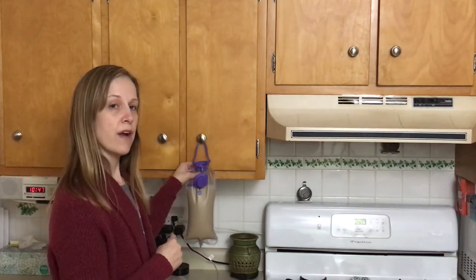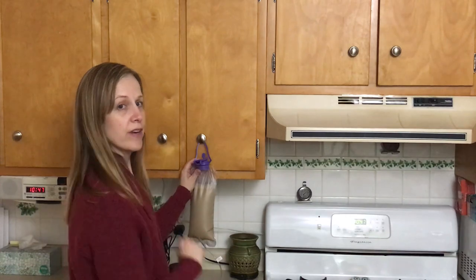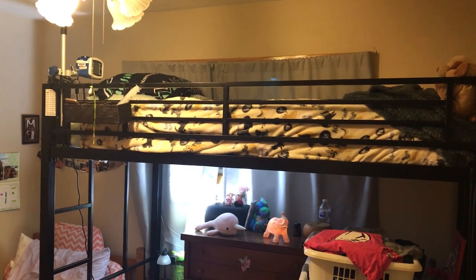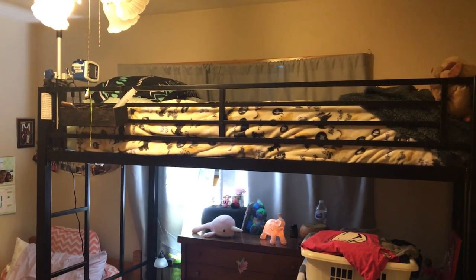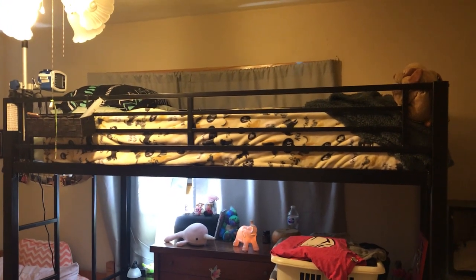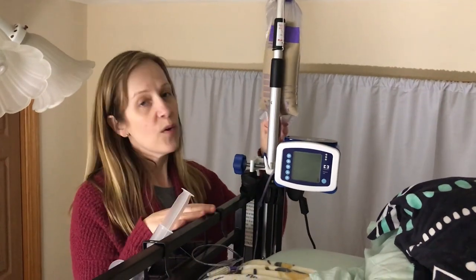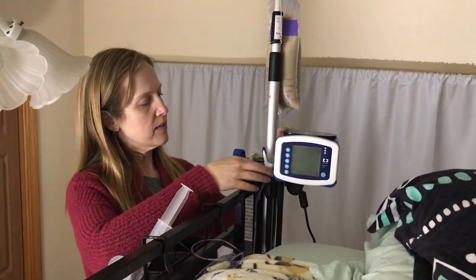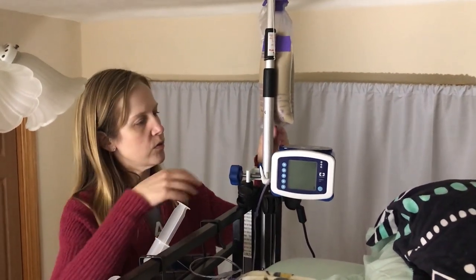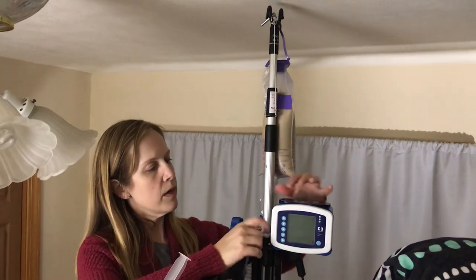Now that all those are in the bag, I'm just going to seal it up, and then we'll transition to her Kangaroo Joey pump and hook it up. Here you can see Faith's loft bed and their somewhat messy slash clean room. This is why we have her Joey pump stationed on her bed — to make it a little easier since it is a loft bed. We're going to work our way up and hook it up. I use a stepladder to get up here. We have a kind of medical pole like you'd have in the hospital, and this is her Kangaroo Joey pump.